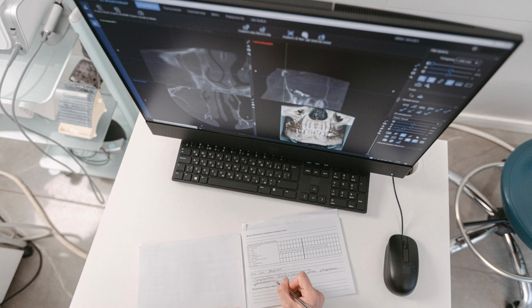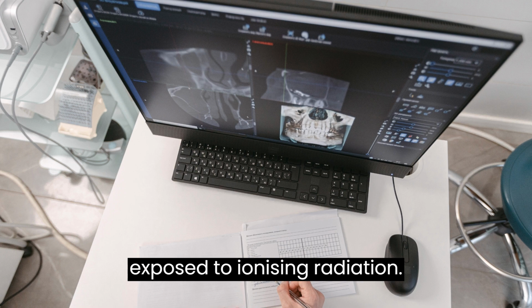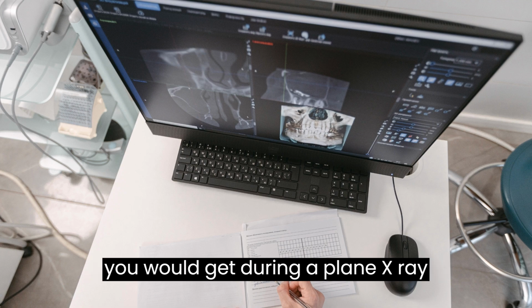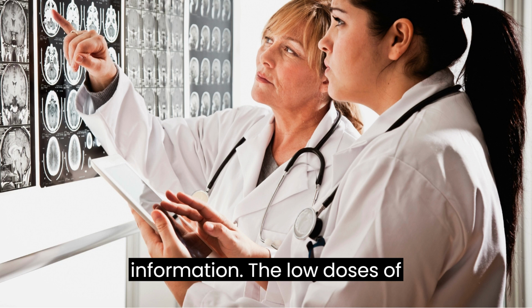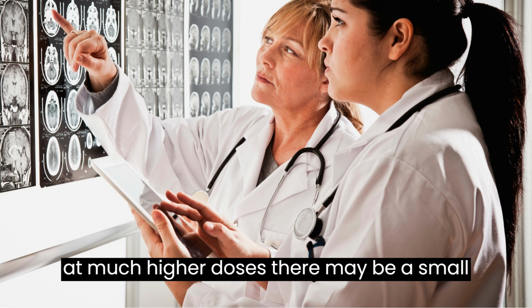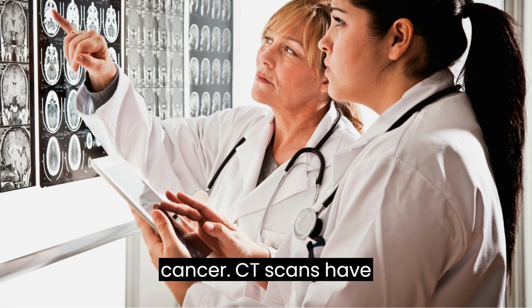Radiation exposure. During a CT scan, you're briefly exposed to ionizing radiation. The amount of radiation is greater than you would get during a plain X-ray because the CT scan gathers more detailed information. The low doses of radiation used in CT scans have not been shown to cause long-term harm, although at much higher doses, there may be a small increase in your potential risk of cancer.